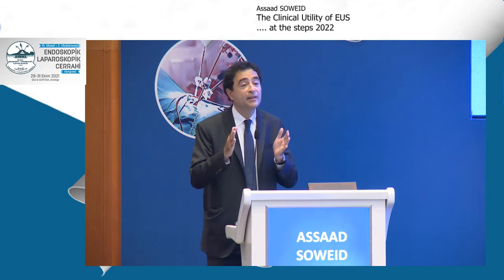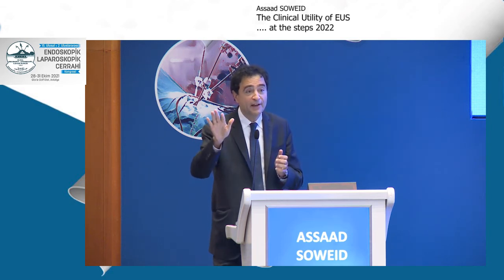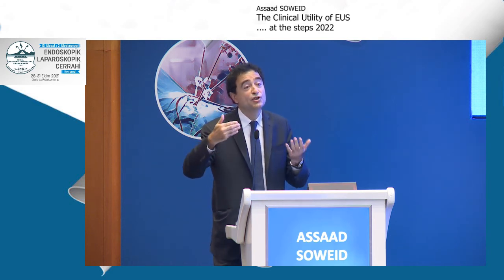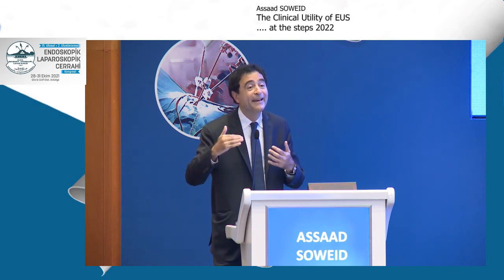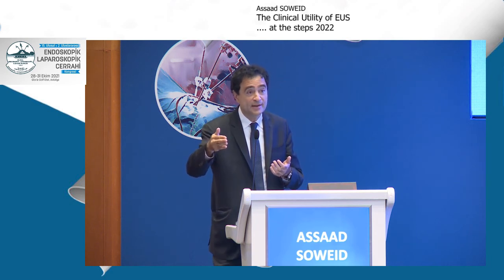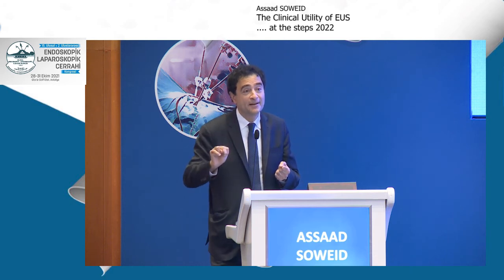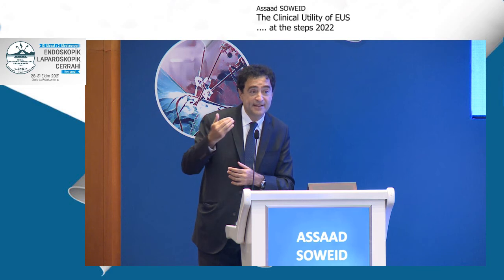And the drainage in the past used to be done by a needle knife without even an EUS, but that's dangerous because of the risk of bleeding. But it can be done, but in case there is no EUS, I advise against it because the EUS would help make it safer. But if a needle knife is done under ultrasound guidance and you open it, you have to dilate the tract with a balloon, and then 2 stents have to be placed, because otherwise, even if it's big, it will close. The cyst is not going to drain.